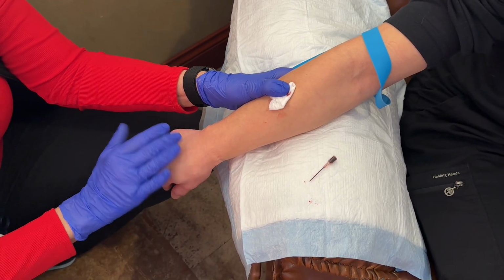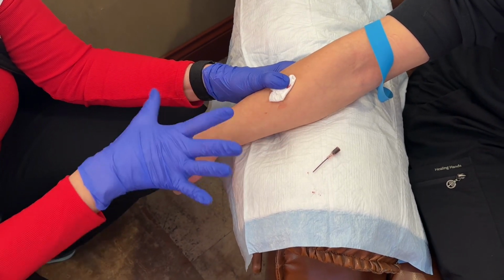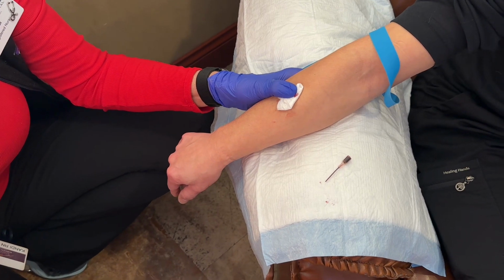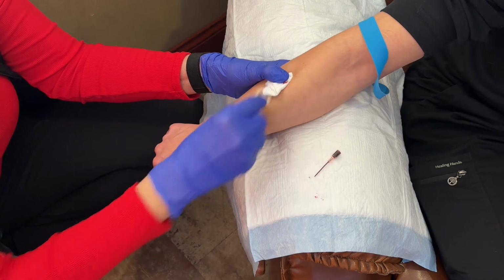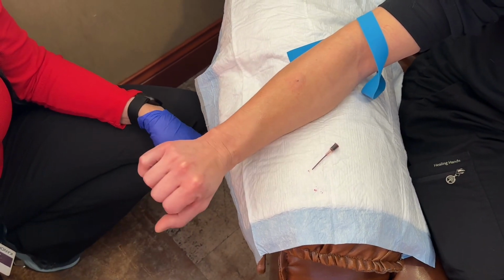If you're second guessing, put a warm pack on. Warm packs do wonders for veins. Put a warm pack on. It will help those veins be a little more proud. So don't be afraid to use a warm pack either. That will usually help also. Steph shouldn't have any bleeding, and as you can see, no bruise, no nothing.